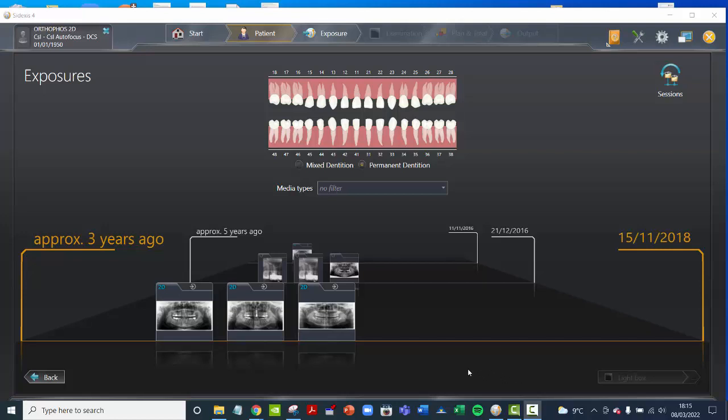This is Rain Leary from Clark Dental. I had a question on how to put two OPGs side-by-side in Sodexis 4, so I thought I'd make a very short video showing that.